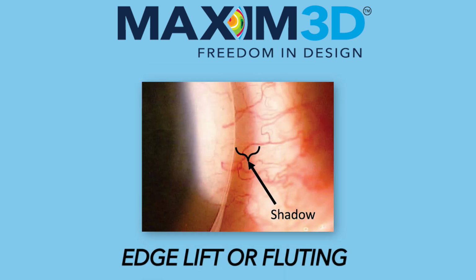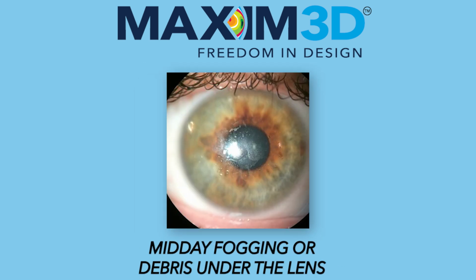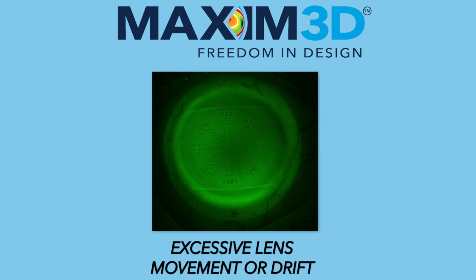The presence of edge lift or fluting. This lift will commonly produce peripheral bubbles. The patient may complain of midday fogging or debris getting up under the lens. Excessive lens movement or drift also signals the lens is too loose.